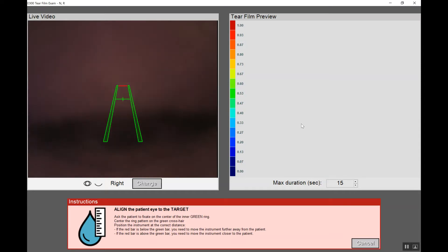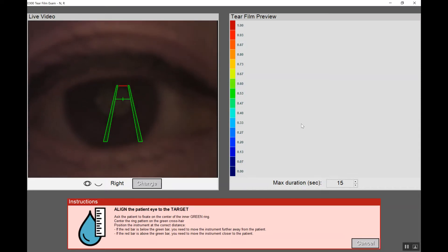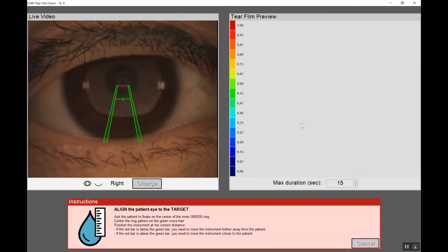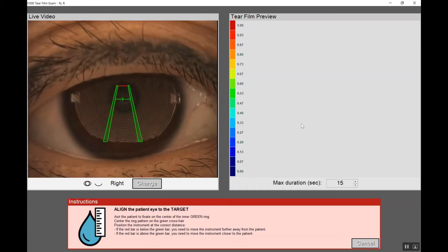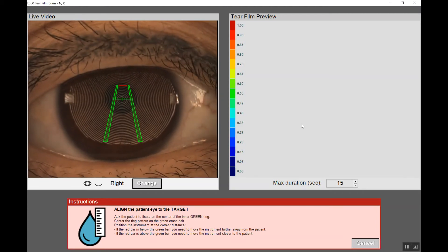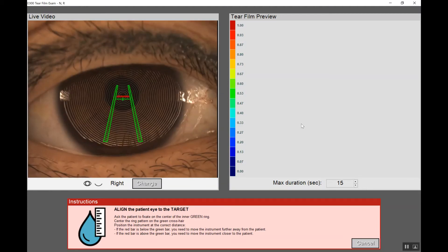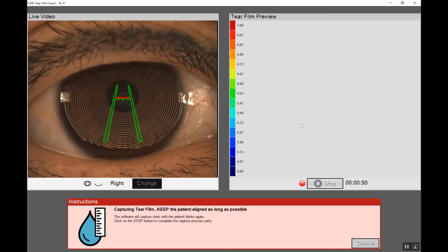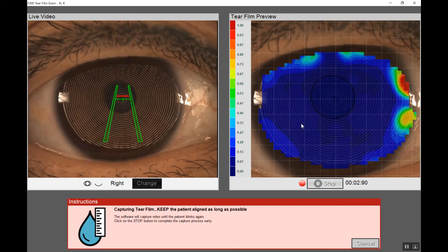Following the instructions, we align the patient's eye to the target. When we get into the appropriate range, the software will ask us to have the patient blink twice. Here we see the test has started and it has recognized the two blinks.